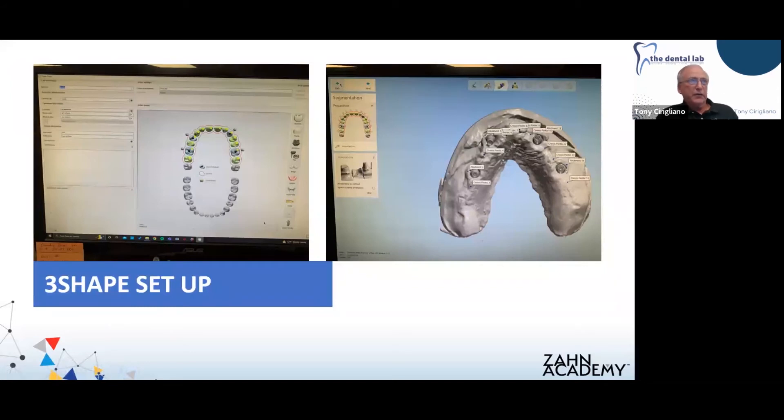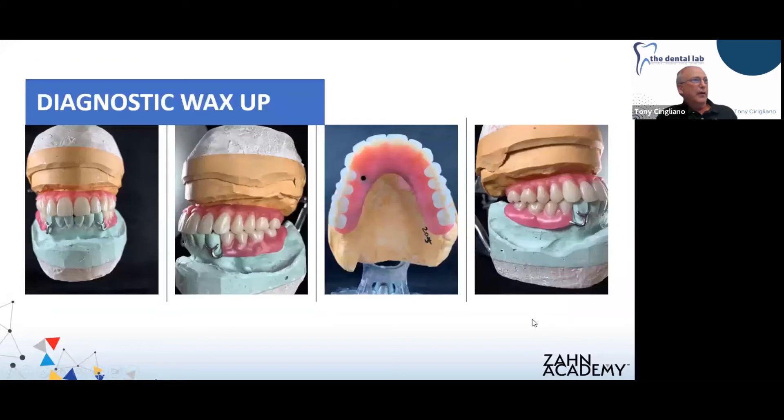After our setup is done, we move on to the segmentation process where we're identifying our abutments and pontics. I'm not going to spend a lot of time in the CAD portion — I'm sure we all have CAD designers in our labs who are much more versed at doing this than I am. I rely on our CAD department heavily — that's their expertise, so I leave it to them.